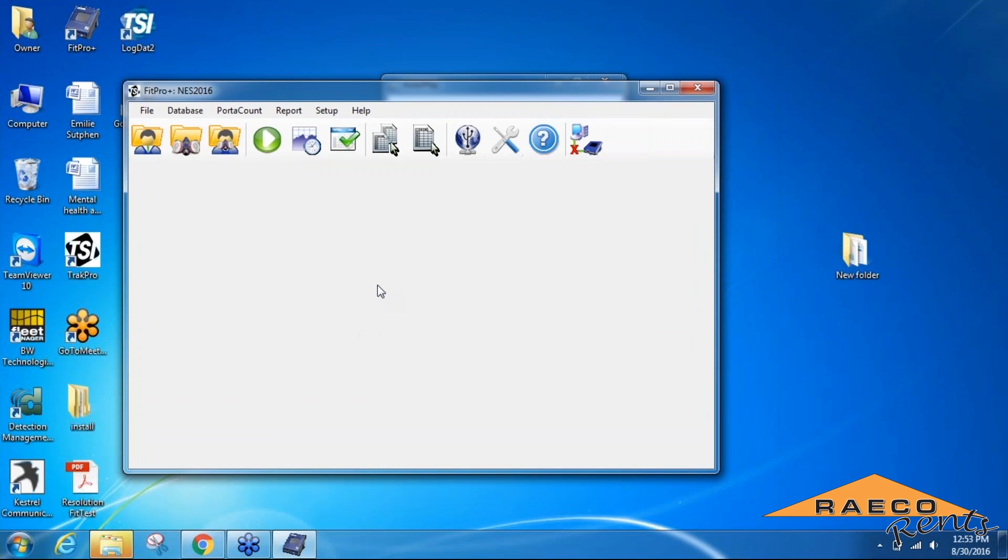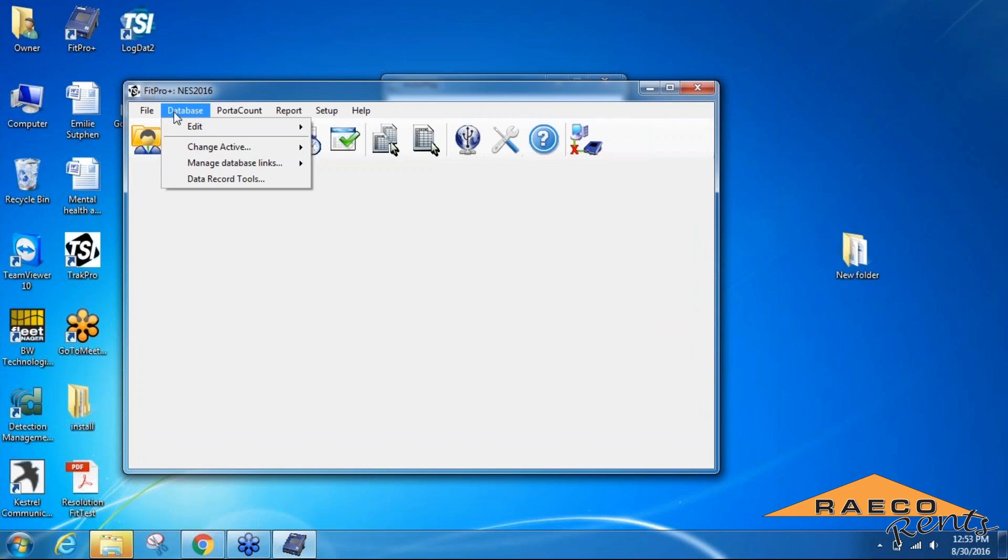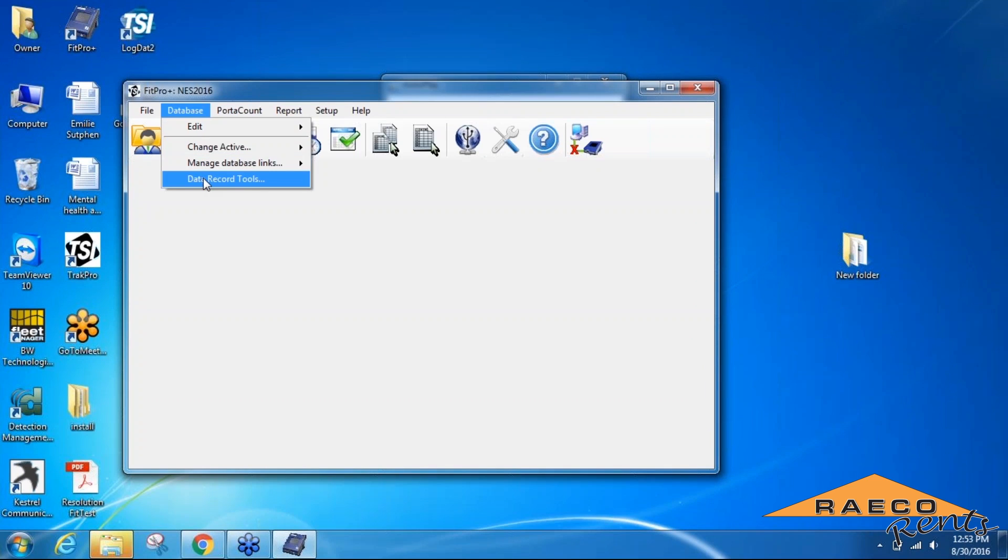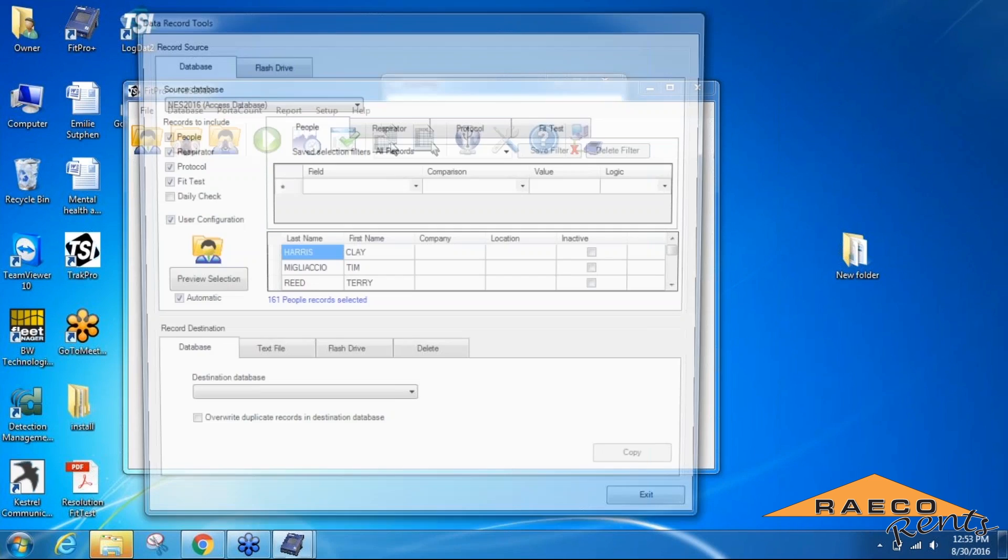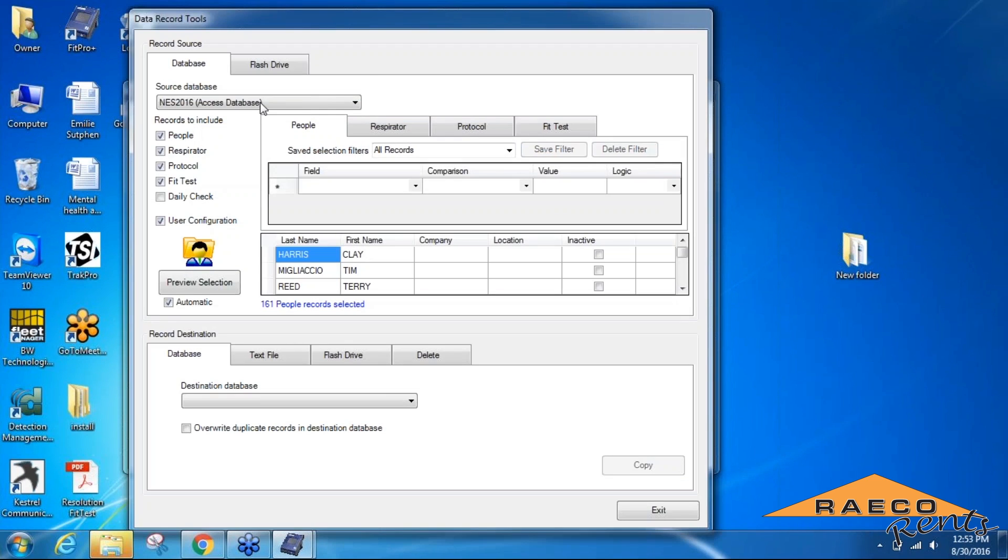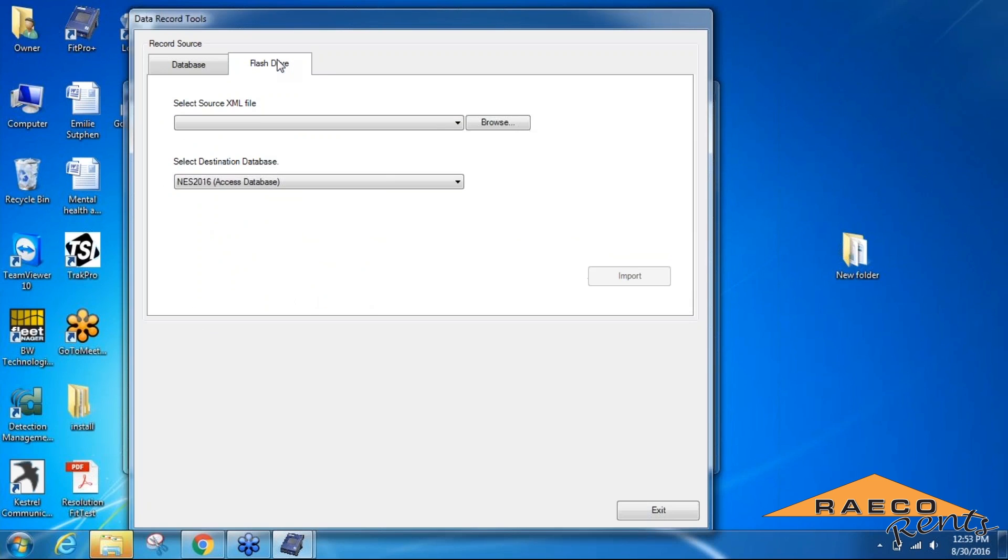Once you're done running your fit tests, we'll come back to the FitPro software. To download the fit test data that you just ran on the port account, we're going to go back to the Database tab at the top of the window and we'll go into Data Record Tools again. We're going to pick the record source as a flash drive this time, since it's saved on the flash drive now, and we'll pick the database file that we created earlier.